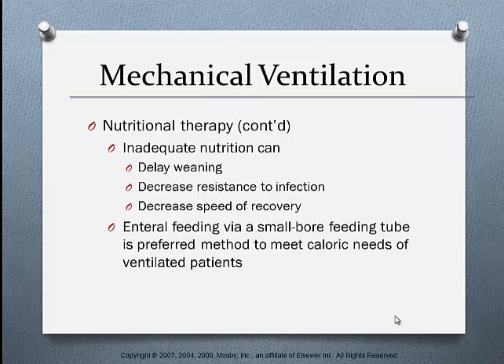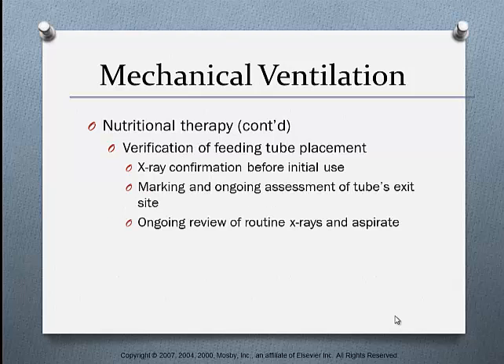Enteral feedings via small bore feeding tube is the preferred method to meet caloric needs for ventilated patients. Verification of feeding tube placement is done by X-ray before the initial use, and by marking the tube's exit site for ongoing assessment. Ongoing review of routine X-rays is also done.